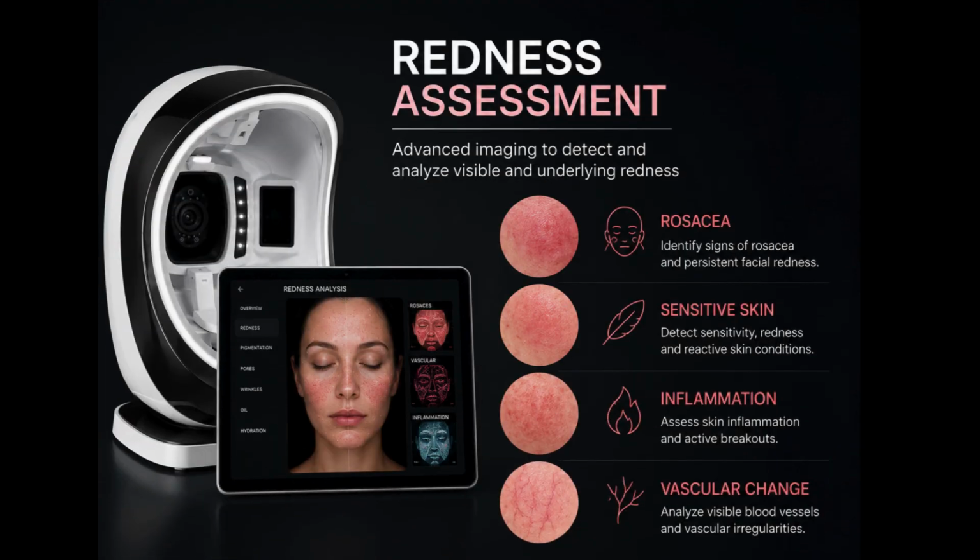Areas of increased redness may indicate vascular change, inflammation or sensitive skin. This can influence treatment selection.